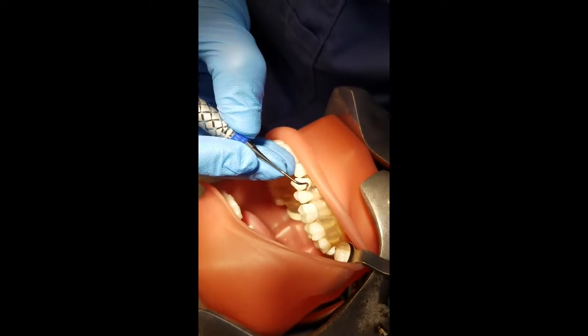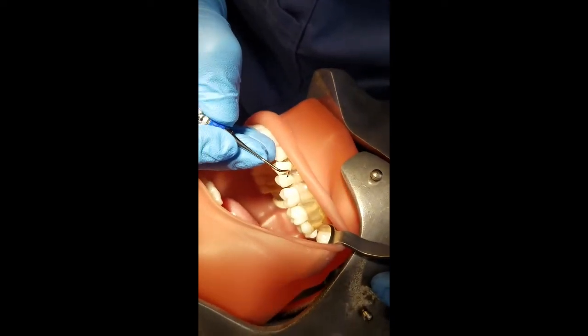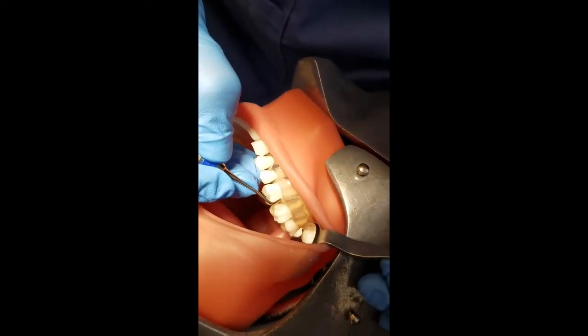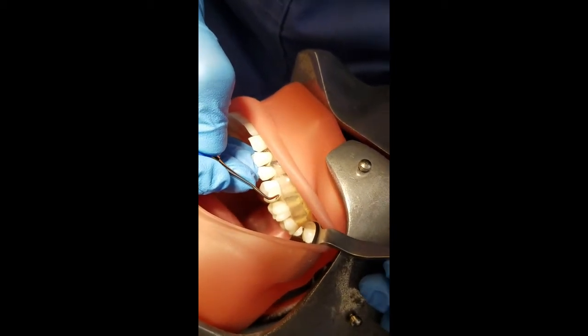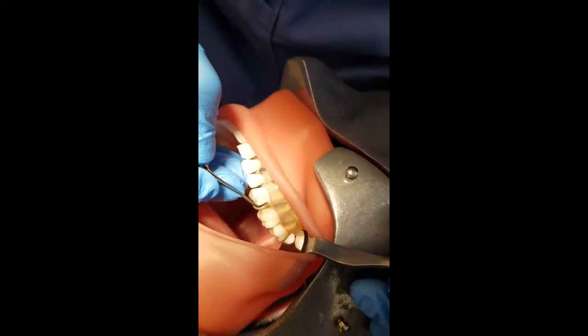To insert this instrument, you need to make sure you have the correct working end by using the terminal shank to guide you. Insert at the Get Ready zone, which is in the middle third of the crown, just 1 stroke before the line angle. The tip of your instrument should be facing in the direction you are going. With the instrument, we start with the distal of the tooth, so the tip should be facing the distal.